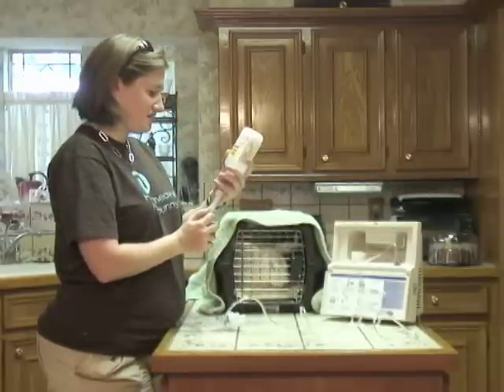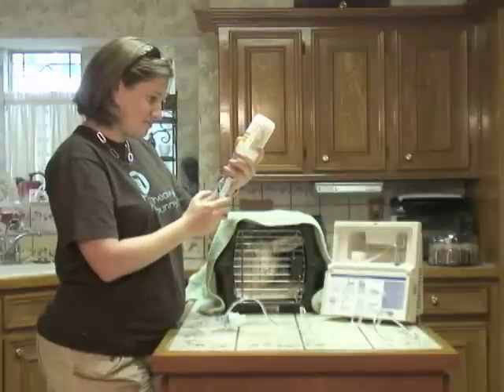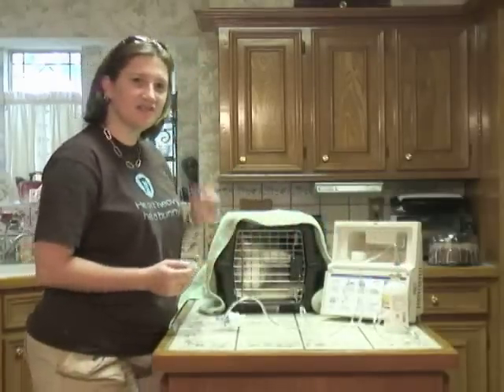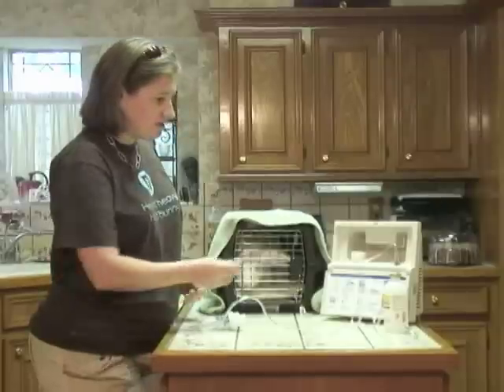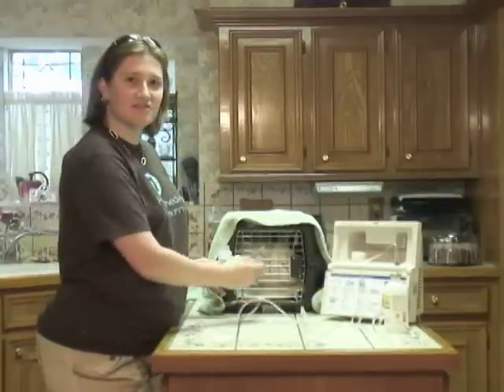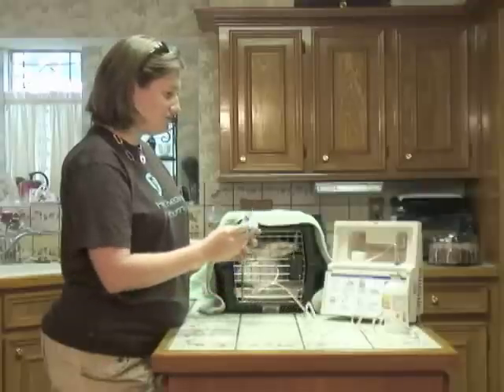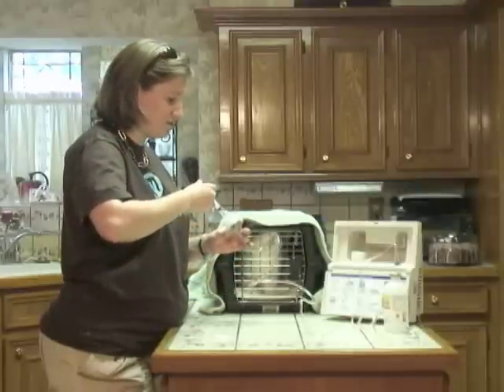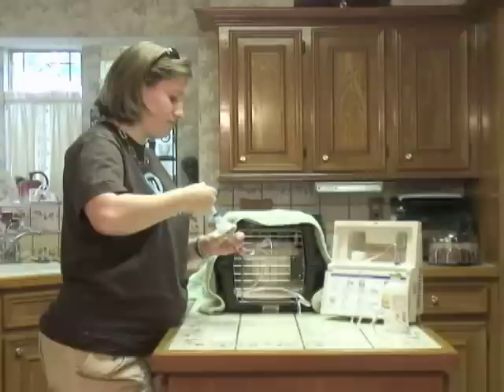You may want to check with your vet, because when we did the mask, since it was directly inhaled, we needed a little bit less solution. Now that it needs to fill up a whole chamber, we're going to use a little bit more. But again, consult with your vet on the correct dosage for the weight of your bunny.